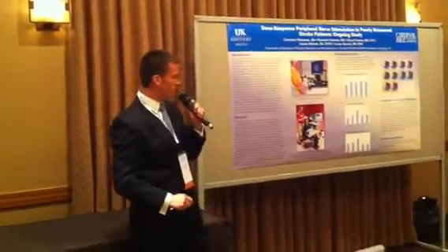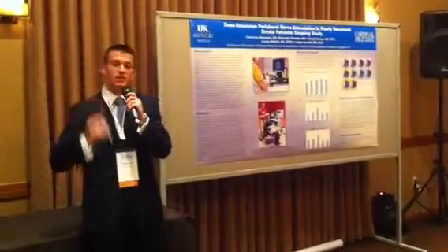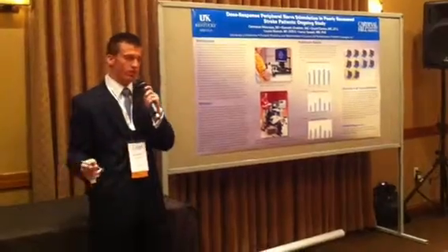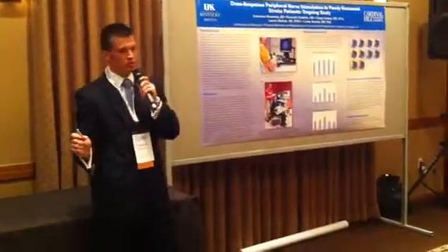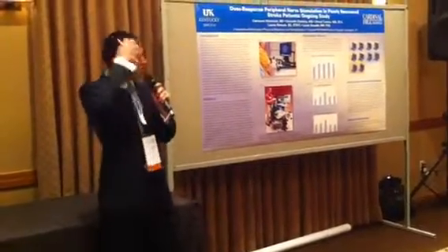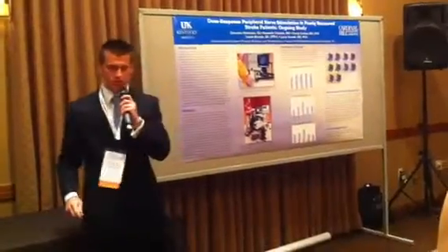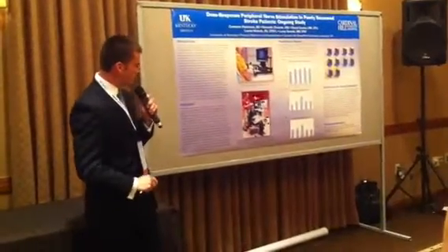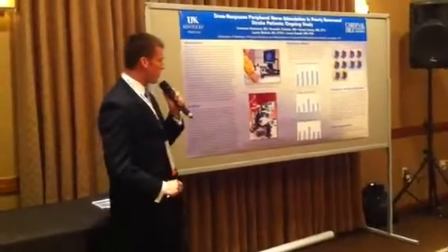With the stroke patients, and especially in the severely affected ones, on the ipsilesional side, we didn't see many maps at all, which is common for that population. However, we mapped the contralesional side as well to see how changes affect neuroplasticity. Does the contralesional side change, and how does that correlate to behavioral measures? That was something we were interested in. So this is TMS. This was what we performed at baseline and post. So let's see what we found out in our results.